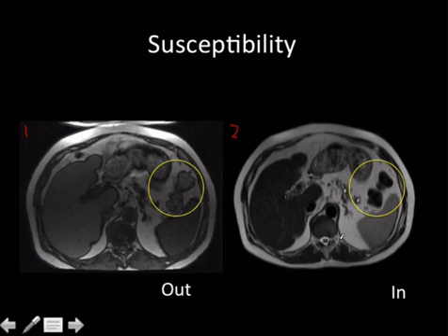Notice that as time progressed, the gas that was in the bowel started causing a problem here. So the longer your TE is, the more susceptible you are to these things. The longer you go in time with your TE, the more and more you'll notice that this susceptibility artifact occurs.